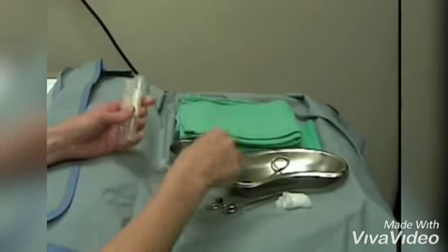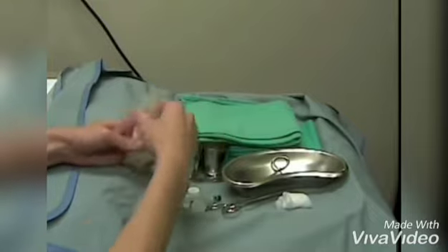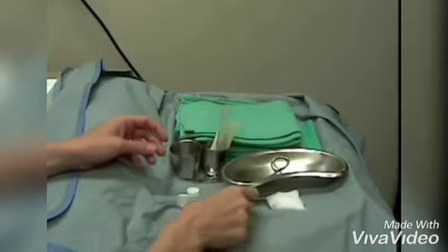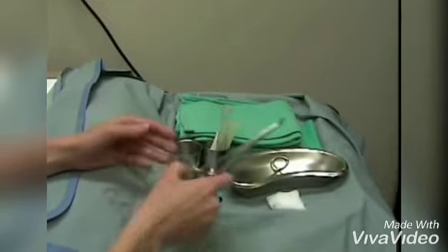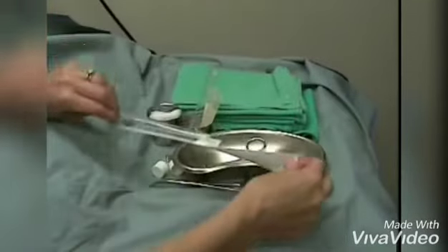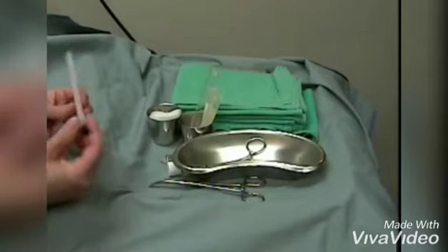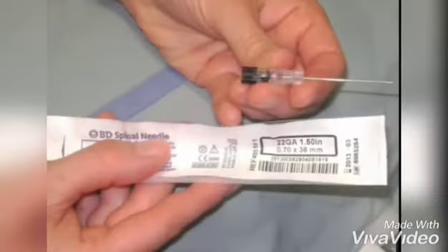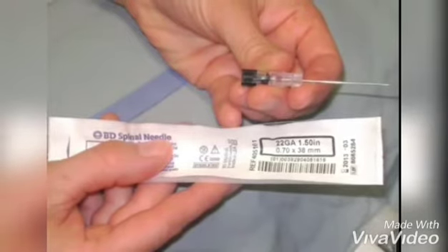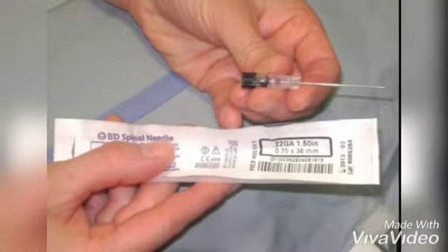Equipment used is a reusable or disposable tray containing drapes, containers, gauze, and the basic instruments and tubes. Tubes must be open before you begin to facilitate filling once you have successfully obtained the cerebrospinal fluid. Open your needle and place it on the tray. Note that there is a stylet within the needle. For infants, you will typically use a 22 gauge, 1.5 inch needle.